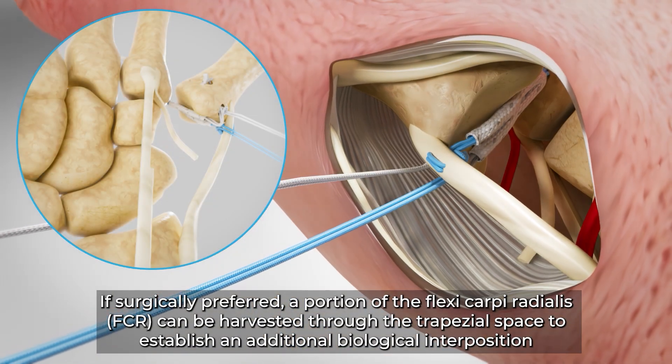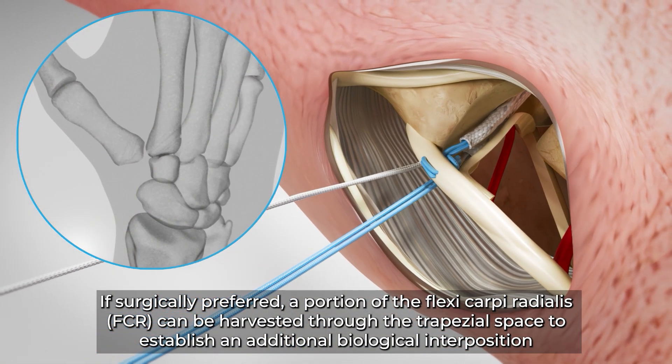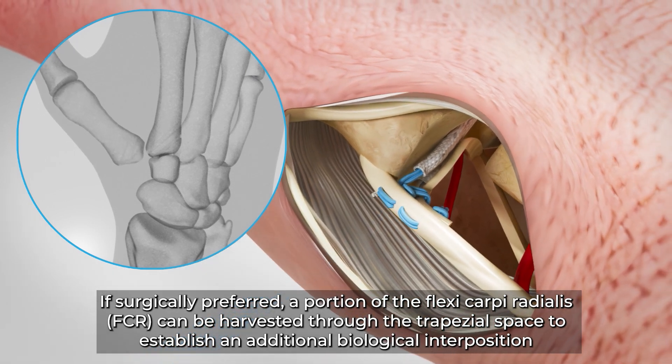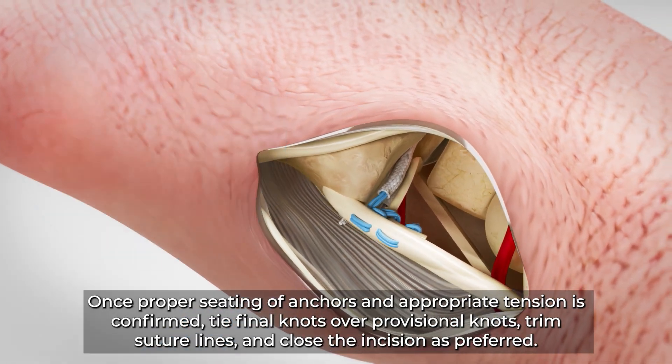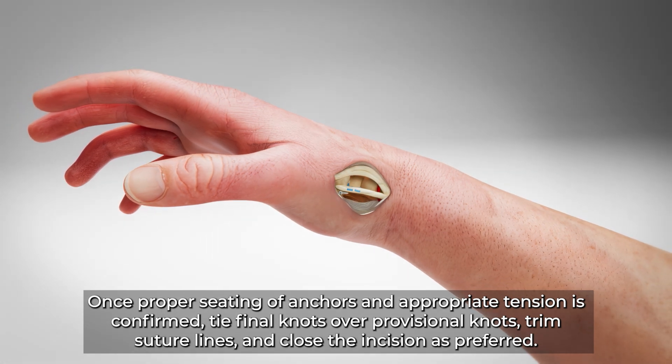If surgically preferred, a portion of the flexor carpi radialis (FCR) can be harvested through the trapezial space to establish an additional biological interposition. Once proper seating of anchors and appropriate tension is confirmed, tie final knots over provisional knots, trim suture lines, and close the incision as preferred.